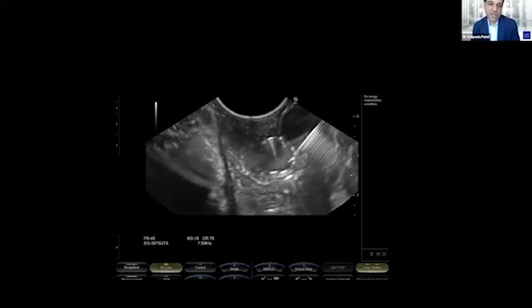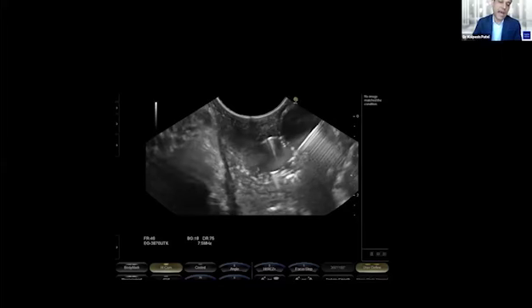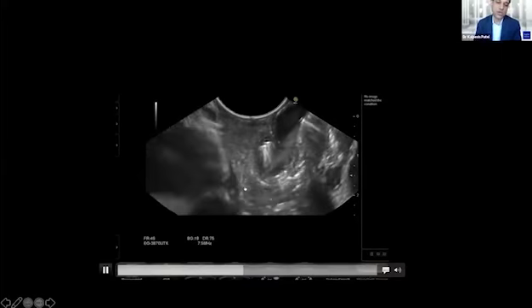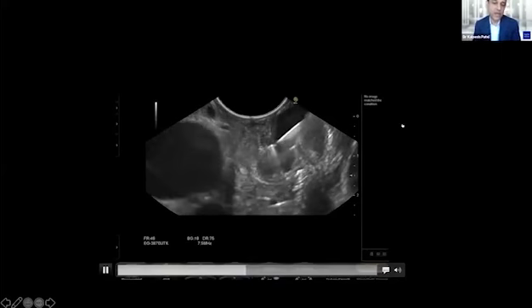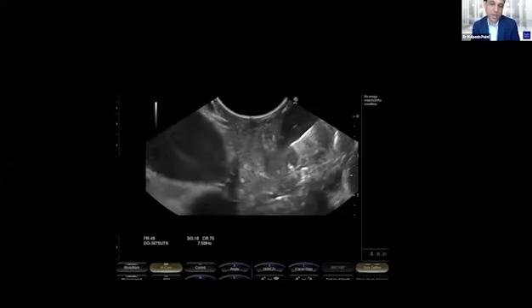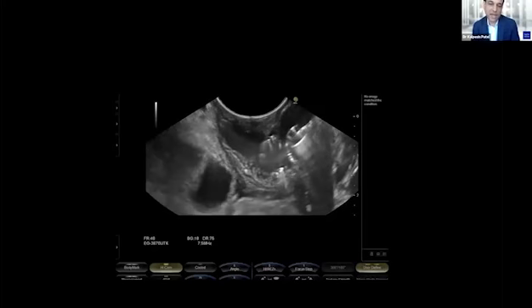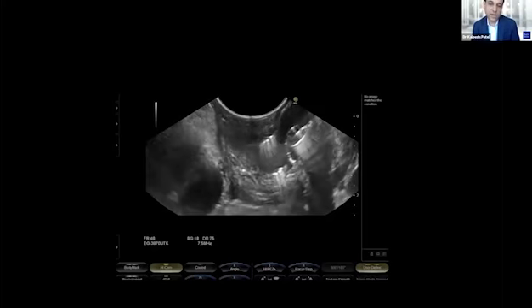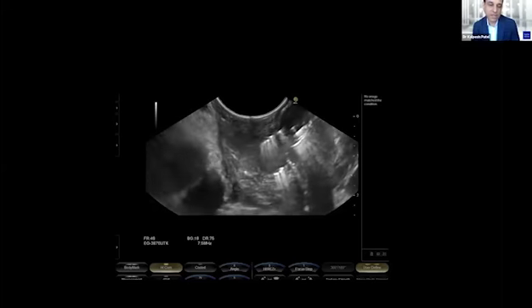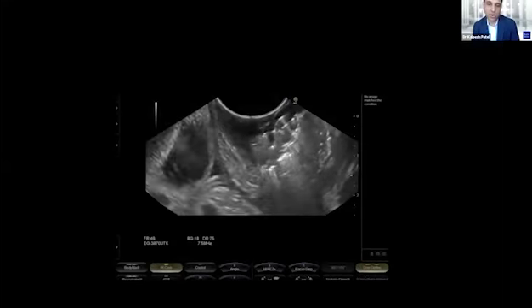There is an advanced technique where the initial coil can begin outside the varix, sort of on this side, in order to anchor it. That is a little bit high risk in terms of causing intra-abdominal bleeding, but Mike Levy at Mayo Clinic advocates that to prevent migration risk. I favor just choosing the biggest coil I can possibly stuff in there to mitigate the risk of migration of the coil itself.